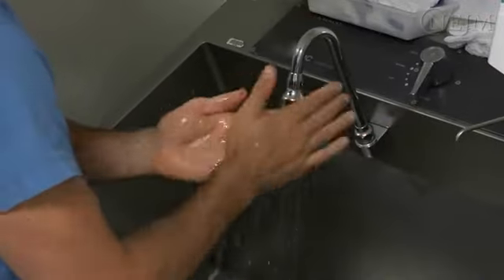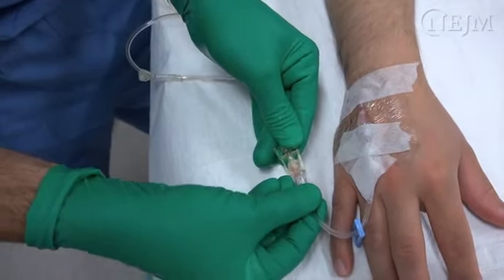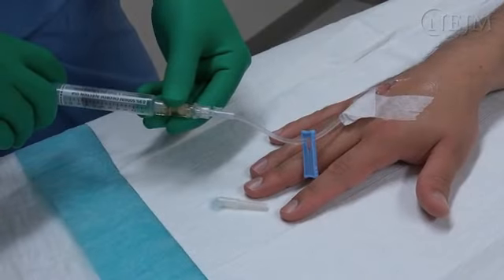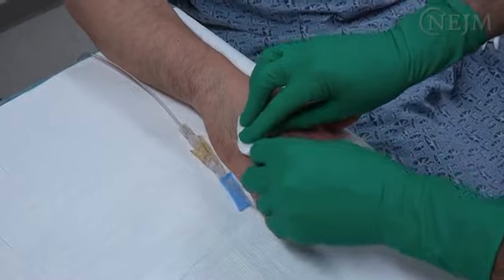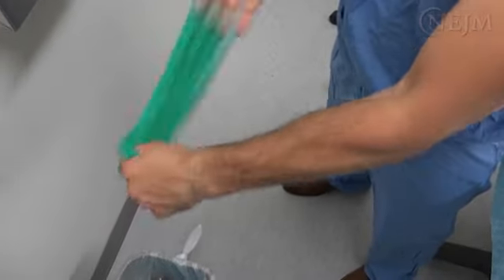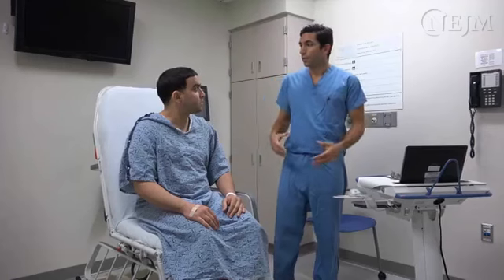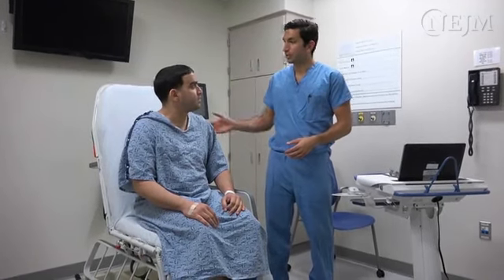If further transfusion is not prescribed, wash your hands and put on new gloves. Reconnect the patient's IV catheter to an IV fluid. Lock the catheter with a heparin or saline lock, or discontinue the infusion and remove the catheter altogether. Remove and discard your gloves. Wash your hands. Continue to monitor the patient for any adverse reactions for at least an hour after the transfusion.